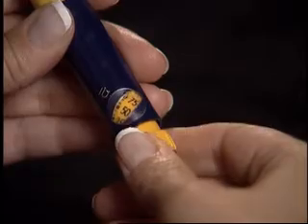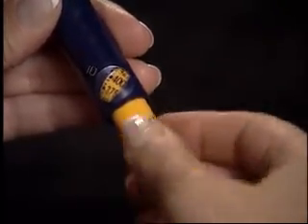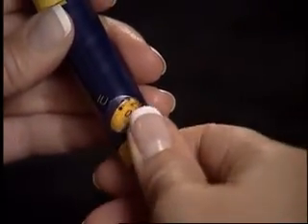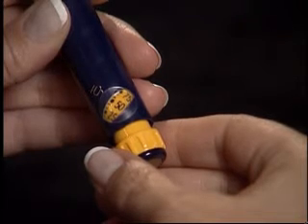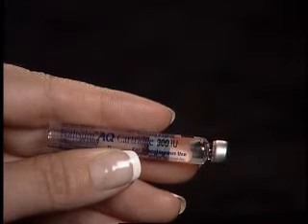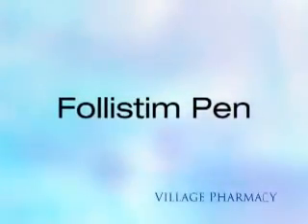Turn the knob counterclockwise all the way out and then push back until the window displays 0. Now turn the dosage knob to the documented remaining dose and repeat the injection process. Do not discard partially filled cartridges as they may be used for your next injection for up to 28 days. This concludes the subcutaneous injection instructions for Follistim AQ cartridge with the Follistim pen.